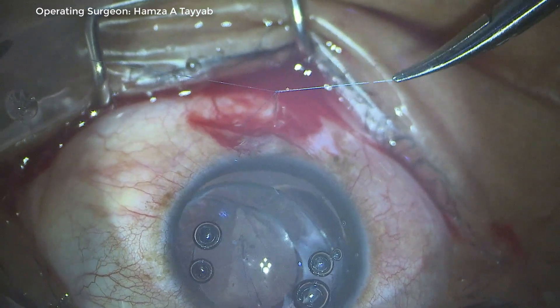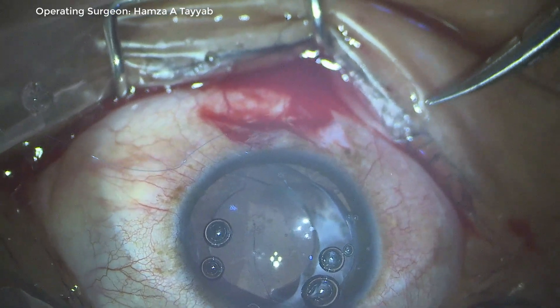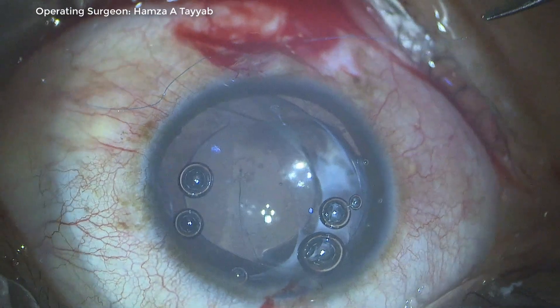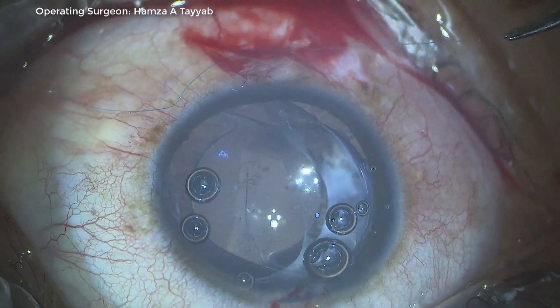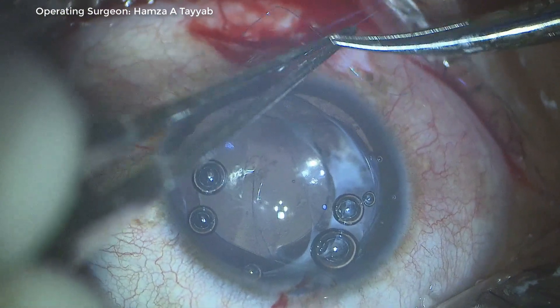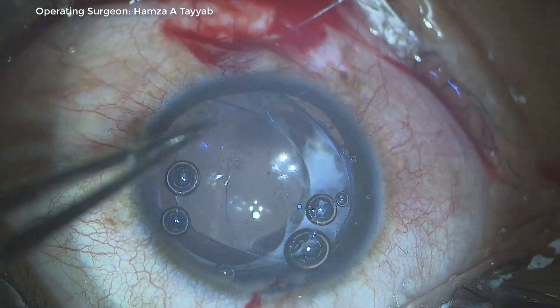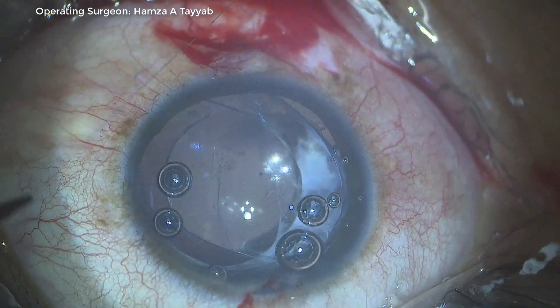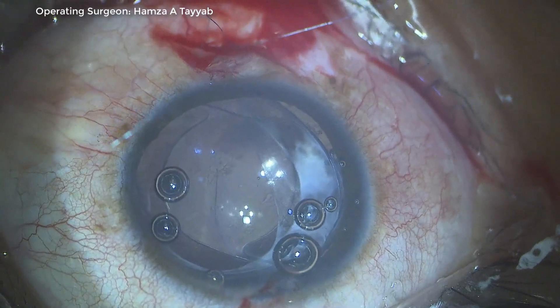I tie the two ends of the double-arm needle after cutting the needle. After adjustment, I make sure I do not tie them too tightly as it might tear the capsular bag. The lens-capsule complex is now partially centered. In retrospect, if I had made the scleral groove more temporally it would have done an even better job, but at this point it is good enough. I tie the two sutures and after confirming and washing out the OVD, I close the case.